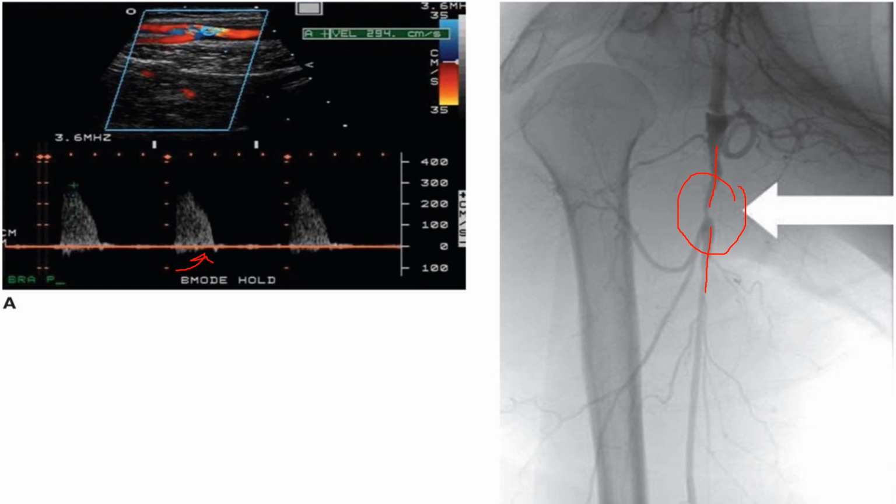Since our blood flow is transitioning out of the subclavian into the axillary, it's reaching this stenosis. What we're likely going to experience in this proximal to stenosis area is an increased level of resistance, to the point where we might even lose some of this forward flow during diastole. So we might be looking at something that stays below the line until the next systole. This would show an increase in resistance as we're coming to that stenosis.